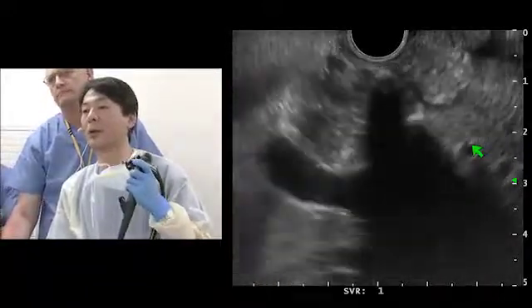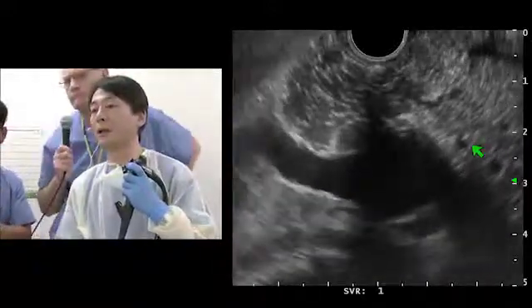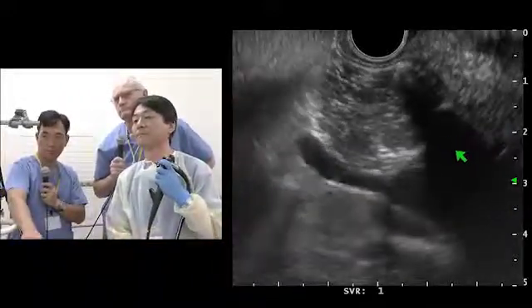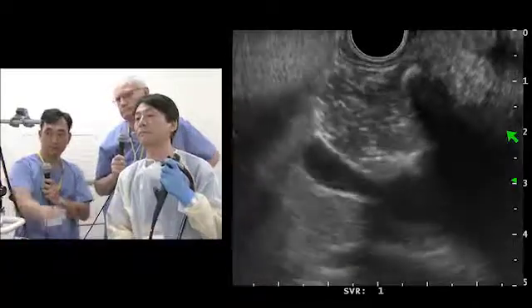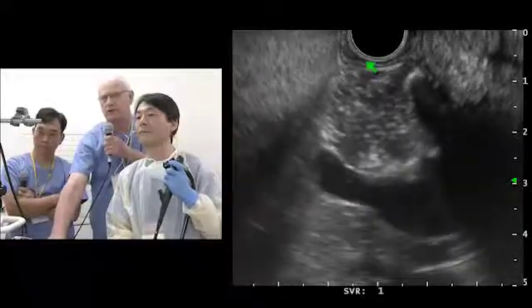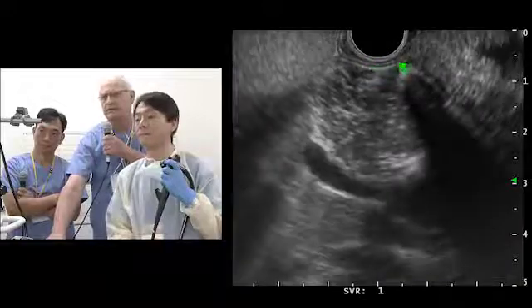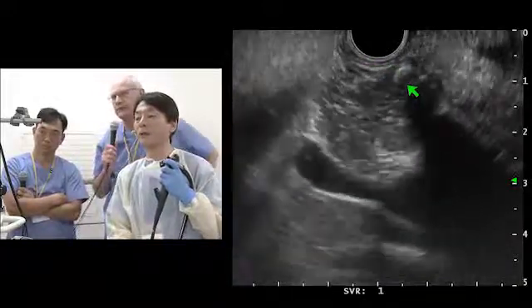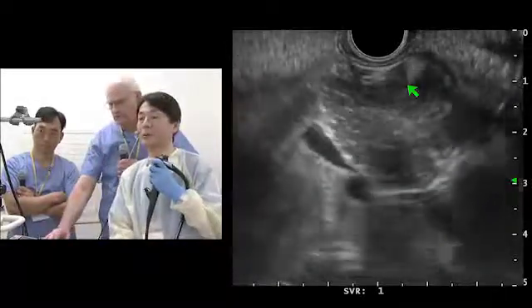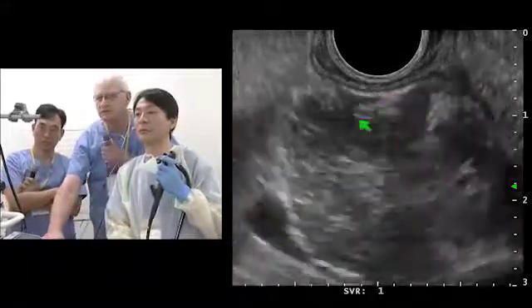We think abdominal tumor. Yeah, as you pointed out, there's pancreas on the right side. So it's just freely mobile, separated from the pancreas. We wanted to look at its relationship to the duodenal wall, and to me, it looks independent of the duodenal wall. If it is from the duodenal wall, the possibility is GIST. However, it seems to move independently.